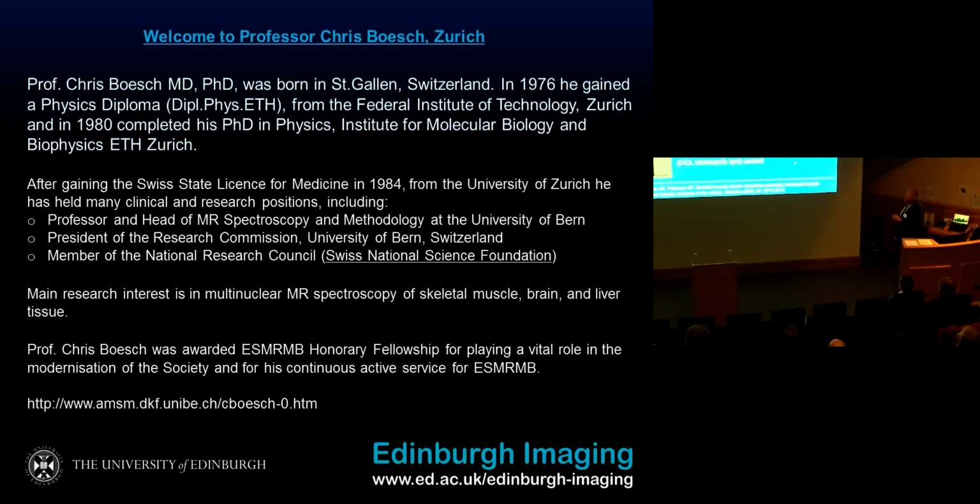The combination of carbon-13 and protons, in the study of the Yale group, what they have done is they had 2 carbohydrate-rich mixed meals in elderly and younger healthy volunteers, and they were looking at the concentration of glycogen using carbon-13 in the upper graph, or in the lower graph, the proton spectroscopy of hepatic triglycerides, IHCL, in the 2 groups. The open bars represent young subjects, while the closed bars represent elderly subjects. We can see there is no difference in the glycogen concentration, but the lipids are increasing in elderly subjects, sorry, not patients, but subjects, who are usually more towards the metabolic syndrome. Even if they are not patients, they are less insulin sensitive than the younger.